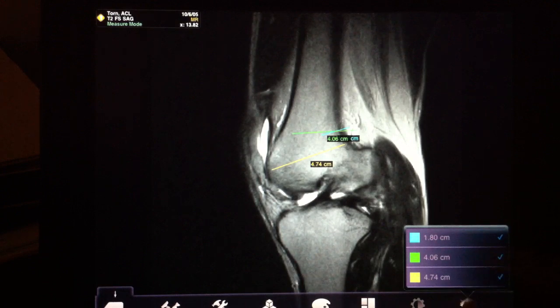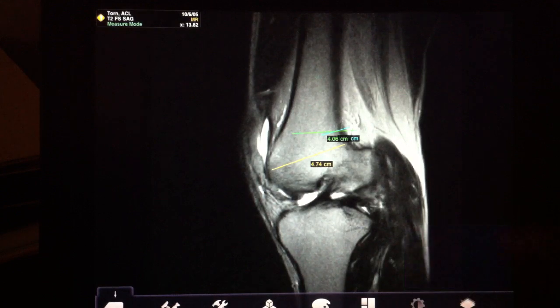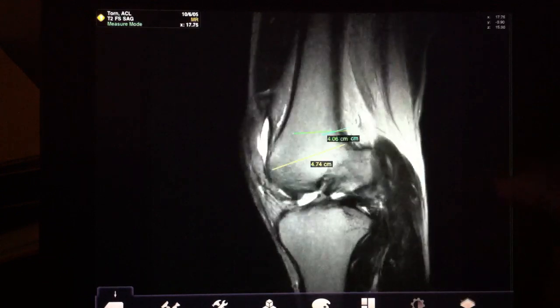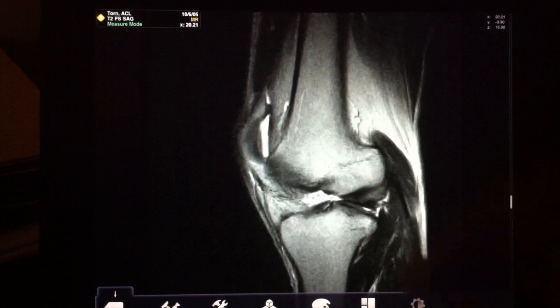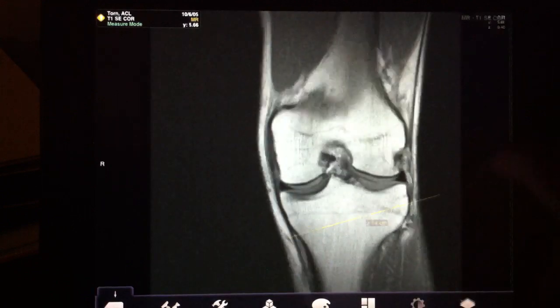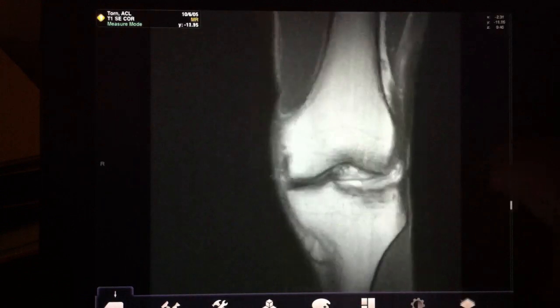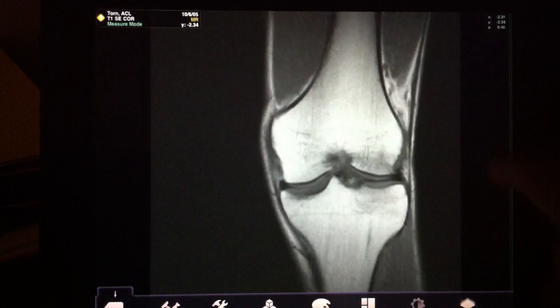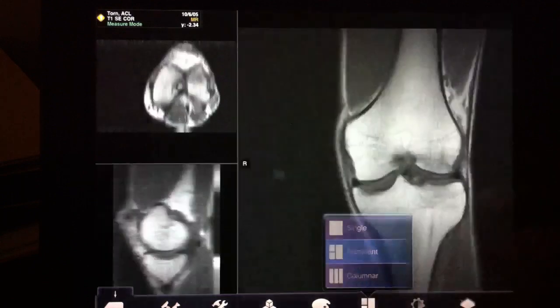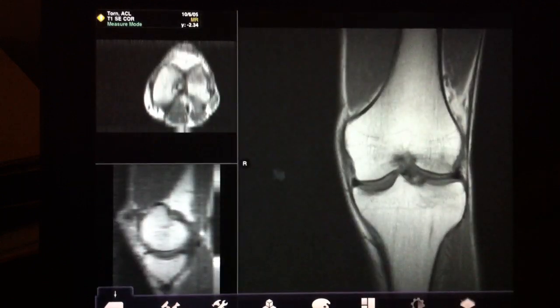As you first saw when we went in, it defaults to actual multi-planar reconstruction. This can be really useful for CT studies, as you can see three planes simultaneously.